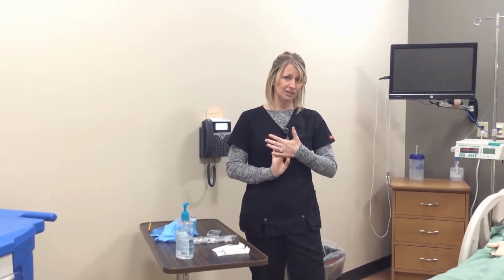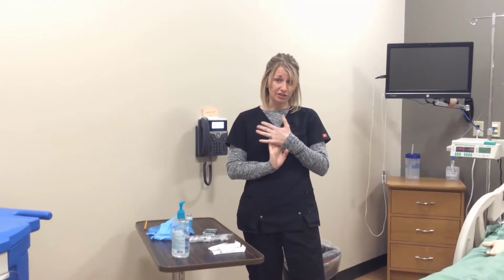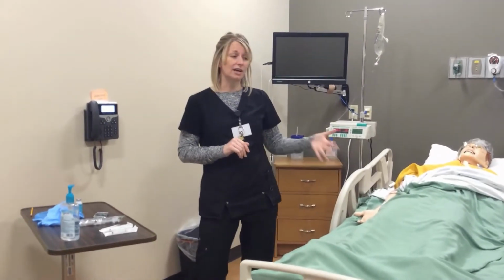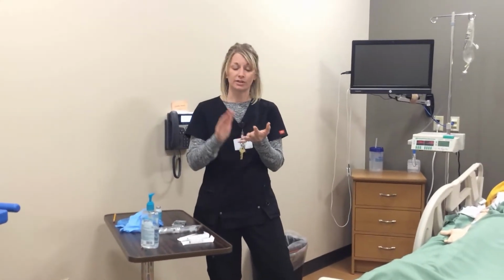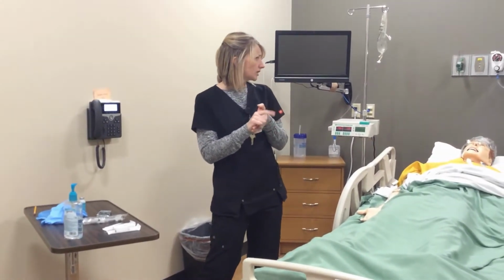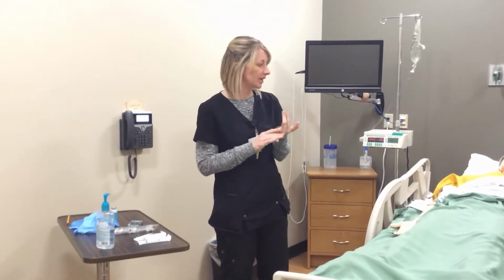Before I give any medications, I'm going to do my 5+5 rights of a medication administration. So I'm going to verify that I have the right patient, that I have the right drug, the right dose, the right route, the right time. I think I said everything there. As well as I'm going to make sure that I do evaluation of the medication afterwards.